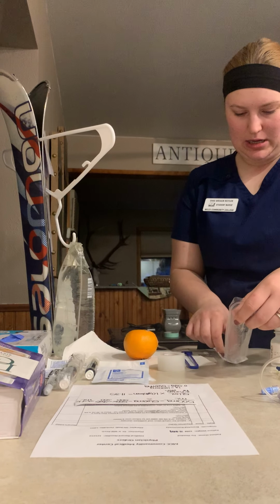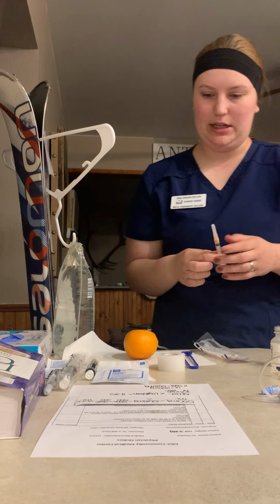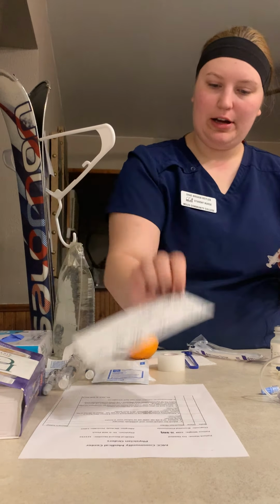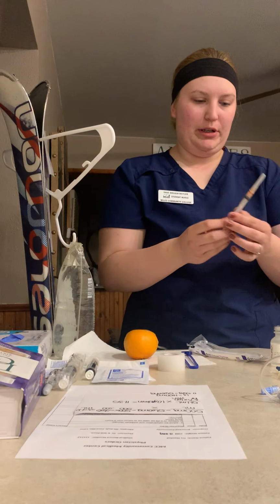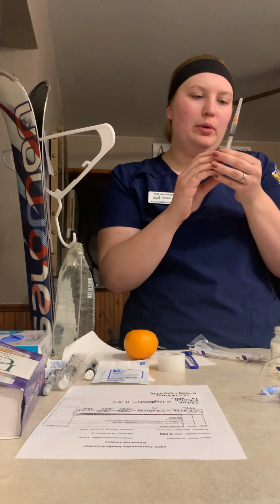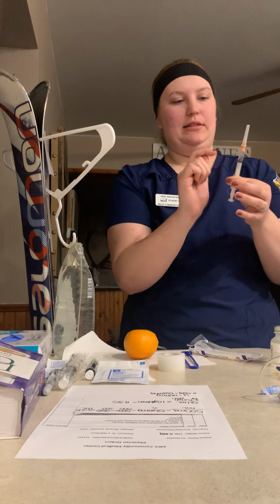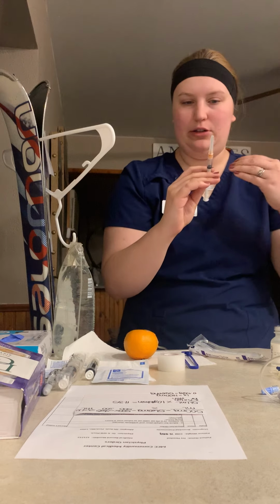I'm gonna open, and I got my 3 milliliter syringe, and I have my med map here. I don't know if you can see that or not, but I got 1.1 milliliters is what we're gonna draw up. So I'm going to pull back 1.1, and this syringe is perfect size because it has each line in between like 1 and 2.